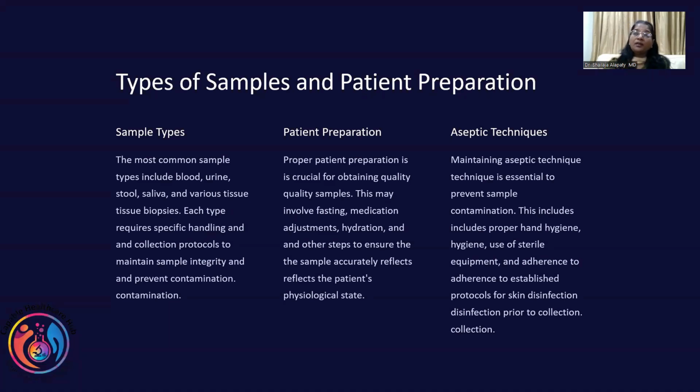And what we have to start with is patient preparation. All of us have to put down our foot and say, patient preparation is crucial. If this patient is not prepared properly, please do not collect the sample. Ask them to come another day. Tell them, sir, your value will be wrong. Please come another day because we want to give your values correctly.